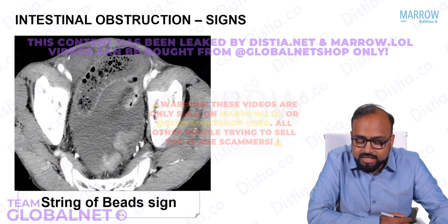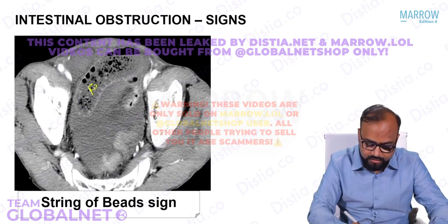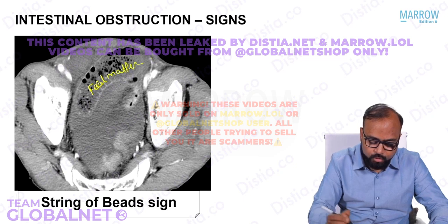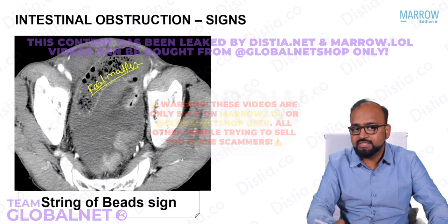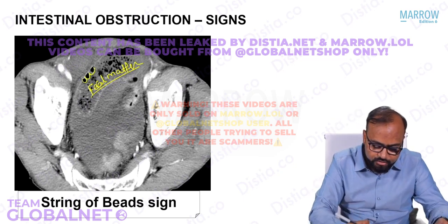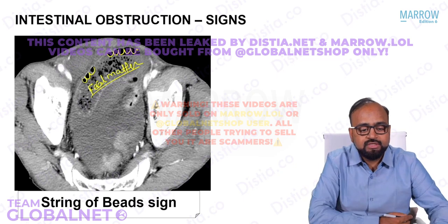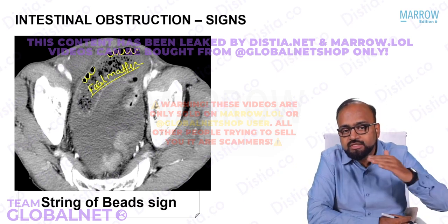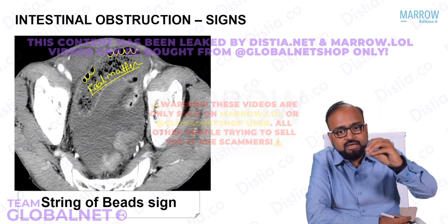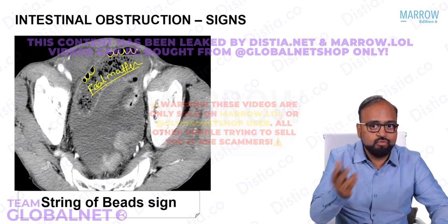Another sign of intestinal obstruction is, now here if you watch this CT image carefully, can you see this fecal matter? So this is fecal matter within a small bowel. This is the small bowel feces sign. But see, in its non-dependent part, can you see these air specks? If there are multiple air specks like this, just imagine this looks like a string of beads, and therefore this is given the name of string of beads sign. These are nothing but air specks that rise up and are collected as beads on the non-dependent part of the bowel loop in between those folds.